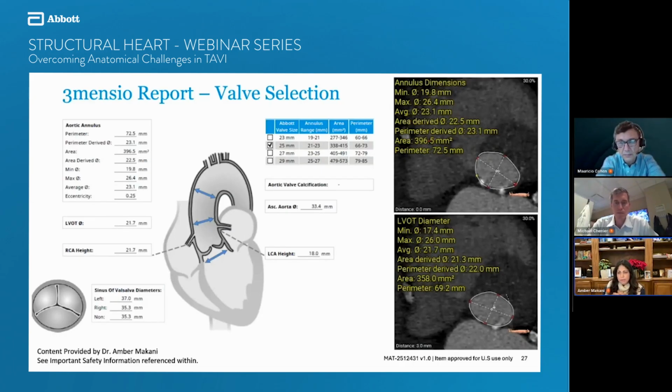From my mind, a large burden of LVOT calcium is not prohibitive for TAVR, but it does warrant a deeper conversation with the patient about expectations. I don't think that I would consider TAVR in a young patient who is otherwise a surgical candidate with a significant amount of LVOT calcium that is nodular and concerning for a significant amount of paravalvular leak.